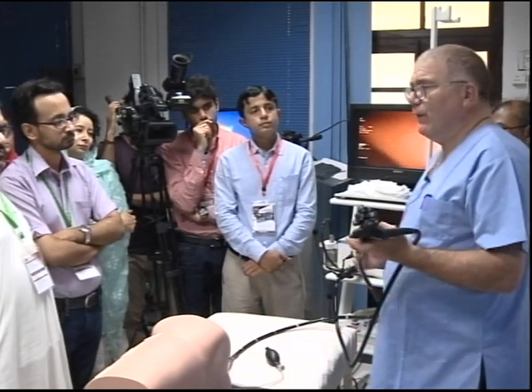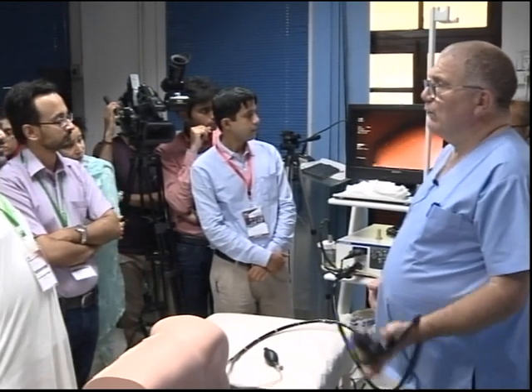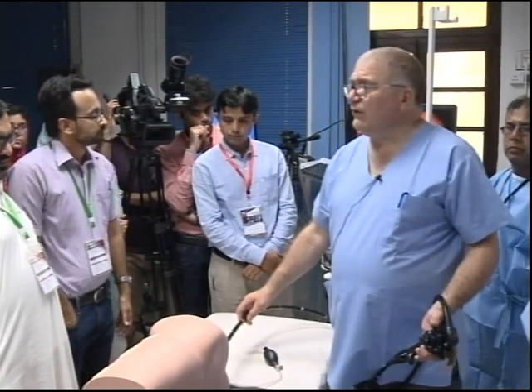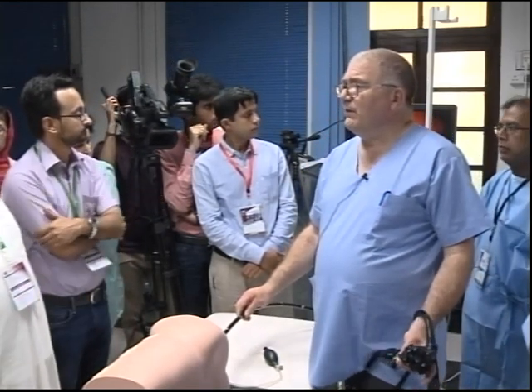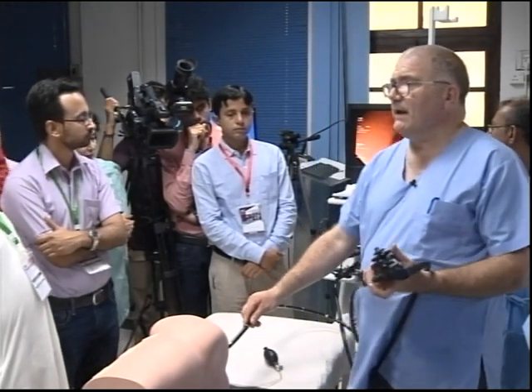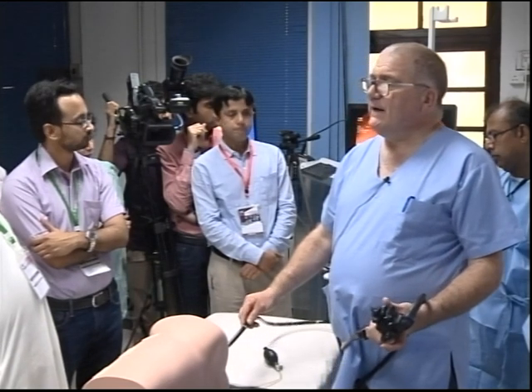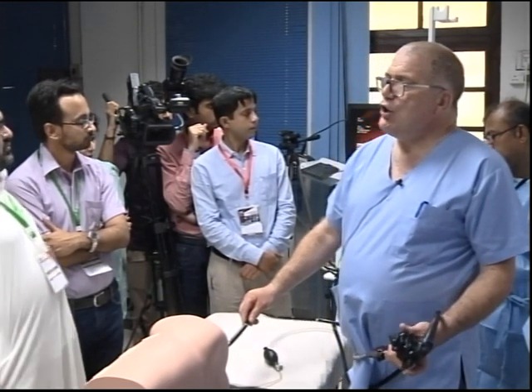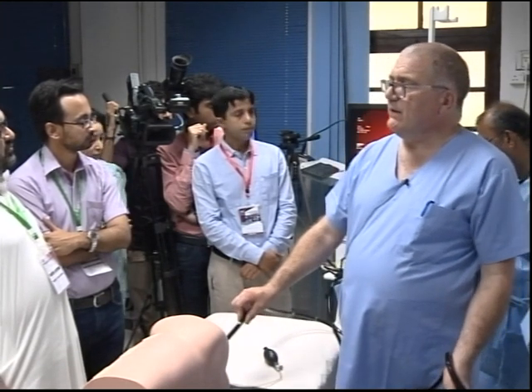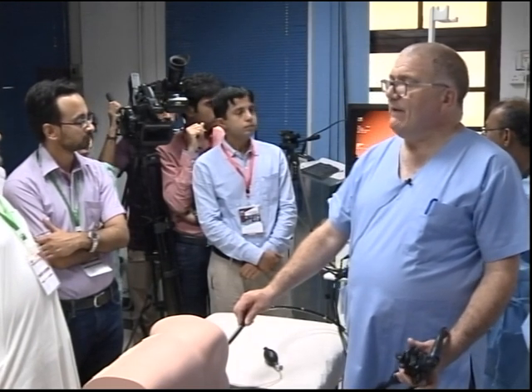So when we want to go forward, look at the scope, anti-clockwise. Have I done anything but the scope? What have I done but the scope and the wheels? Nothing. I have adjusted my position. I get the scope forward, scope comes back. You can actually hold the scope in your hand. It sticks a little bit because it's a mannequin. Clockwise torque, let the scope go forward. No air, you can see a little bit of liquid. Do we aspirate it? No. Do we go forward? Yes. The clunkiness is because there's not enough lubricant, but don't worry about that. It's a mannequin. I'm not putting any air in at the moment.